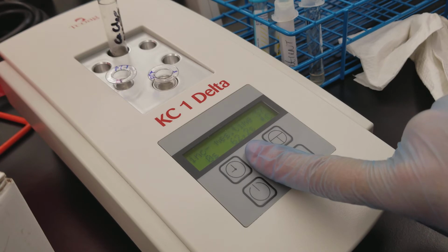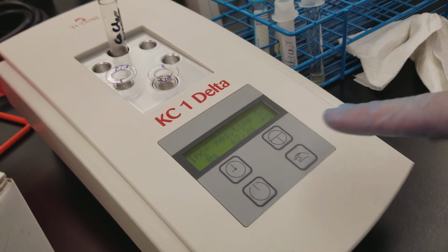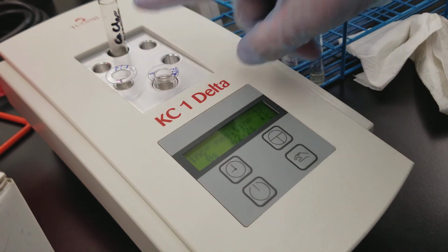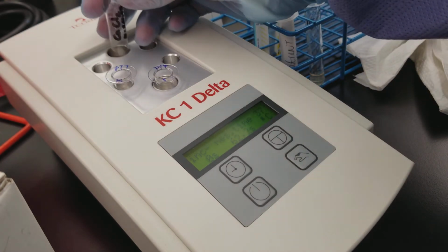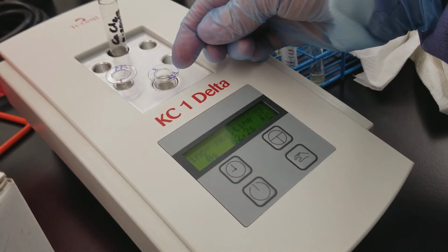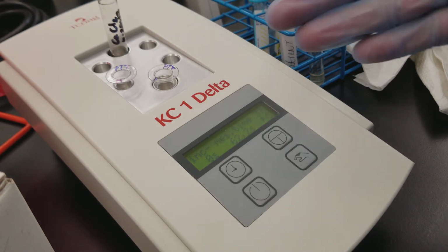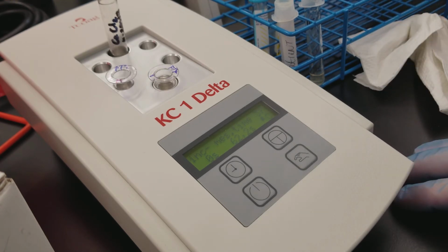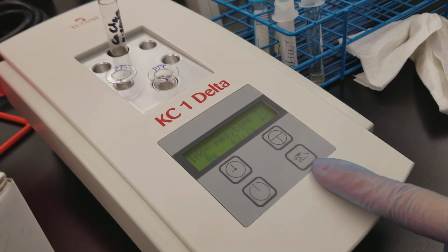After it says that the time has been exceeded, you press the clock face. Okay, and that's going to let you add the reagent. So you saw I added the calcium chloride, and then I hit the hand. That is the start button. As soon as I put the calcium chloride in there, chemically inside the cuvette, the plasma is already starting to want to clot because the calcium has now been reintroduced into the plasma, okay? And the environment is correct and right in order for a clot to happen. So it's ideal at that point. And so as soon as we add calcium chloride, we want to start the clock, and that's what the hand is for, okay?